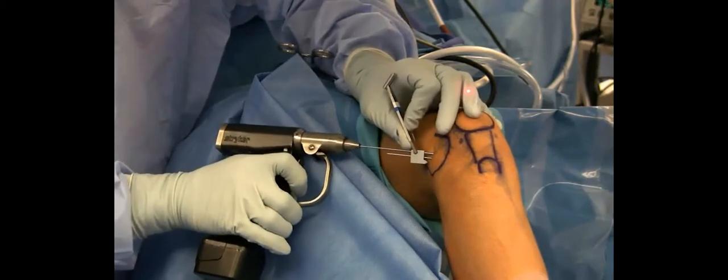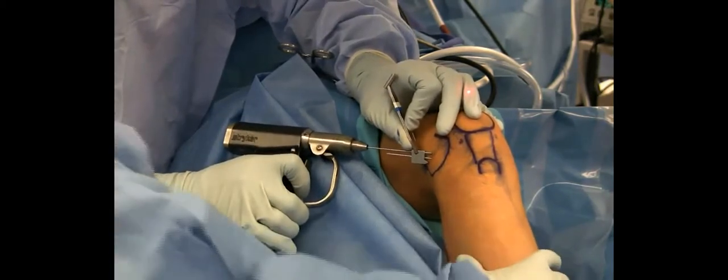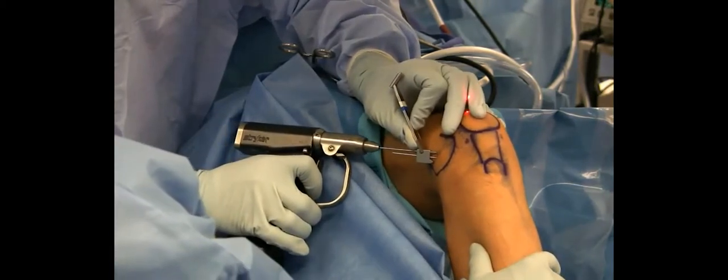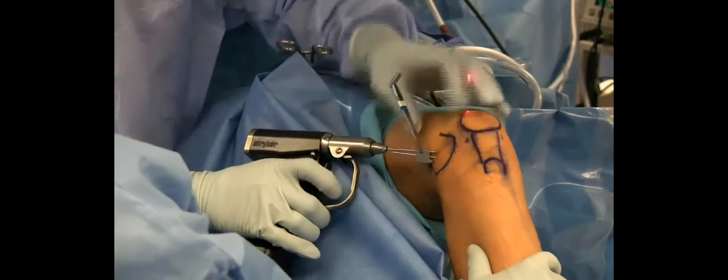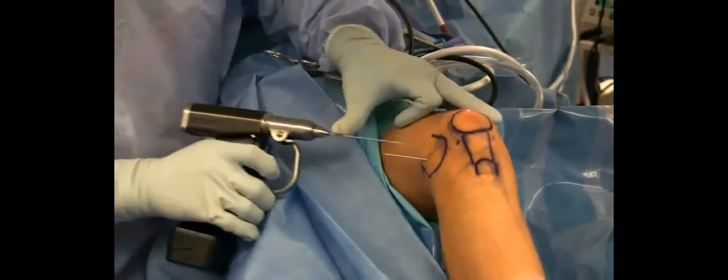Here we are coming in with our next drill. Once again, the K wire is advanced down to the lesion, and we confirm it both on the AP and lateral views.